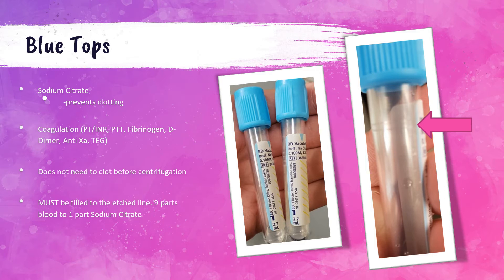These coagulation tests determine when a clot is formed and produce a result from that, so if the specimen in the tube is already clotted you're going to get an inaccurate result. There is a critically important piece of information on light blue tops: the etched fill line. As you can see in the arrowed picture, this is a minimum fill line — this is not a suggestion. These tubes must be filled to the etch line or they need to be rejected for redraw. This tube contains a very specific anticoagulation ratio of nine parts blood to one part sodium citrate.